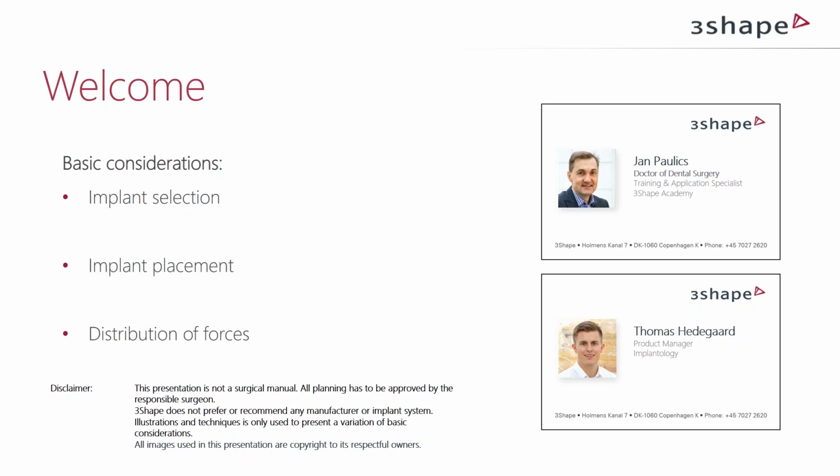Remember that this is mostly for non-surgeons, because as a surgeon you already know these three items, but it's sometimes good to go back and rehearse again, or to just see it from another surgeon's point of view.